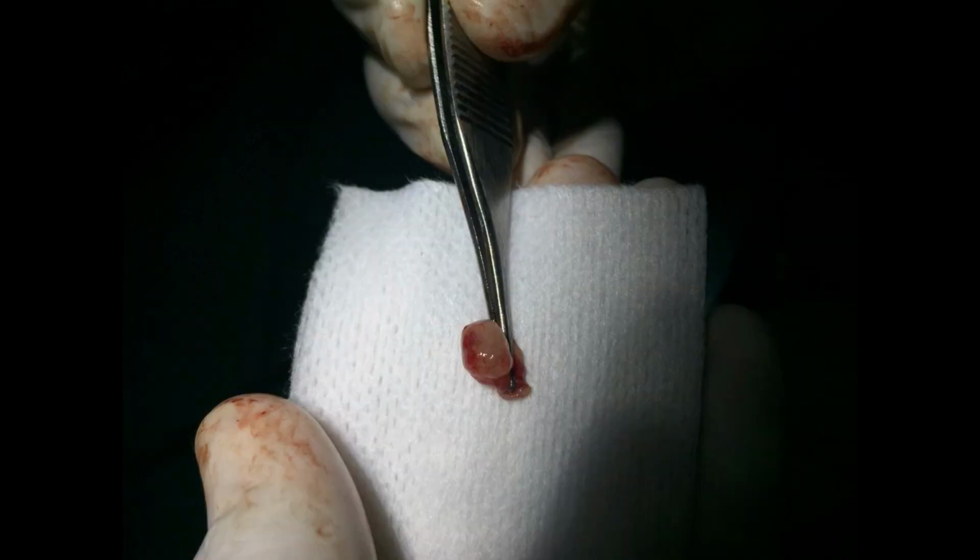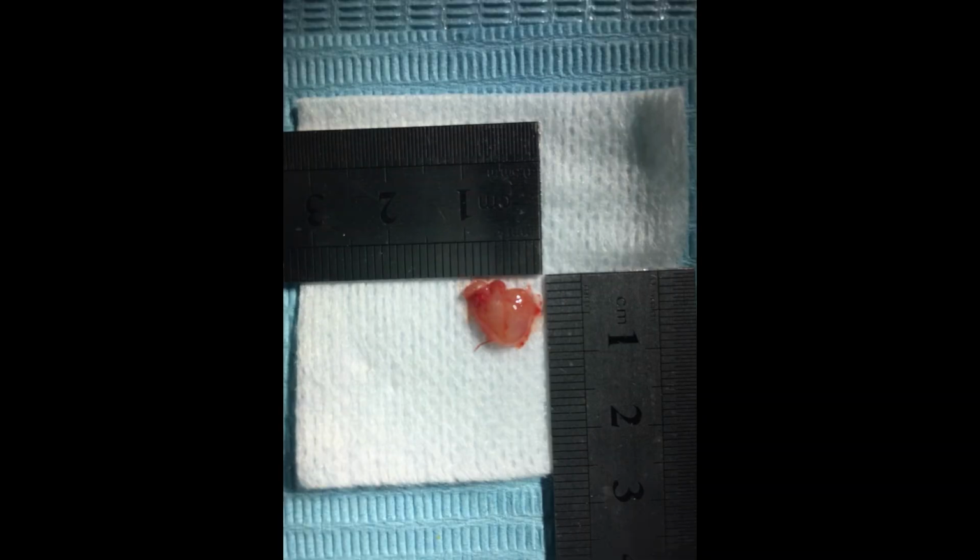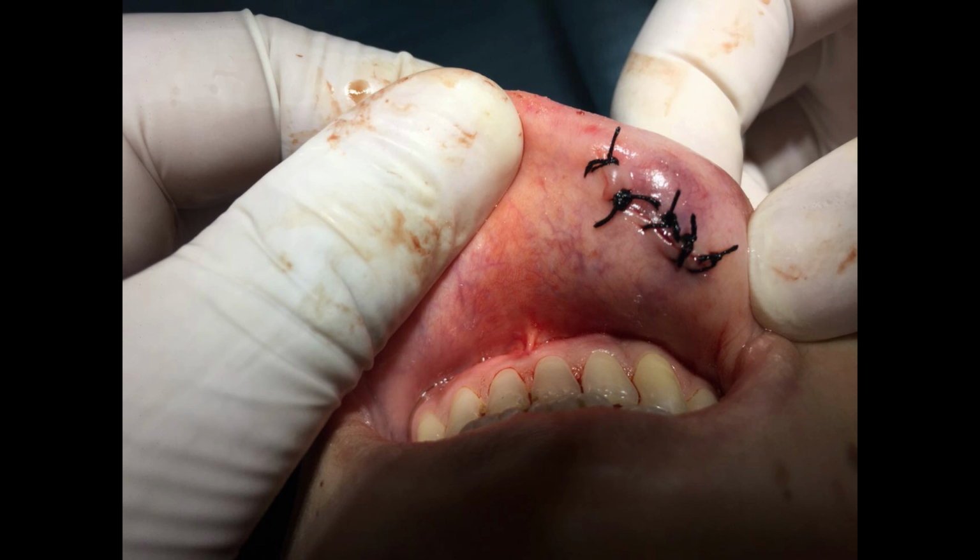The area afterwards was closed using 3-0 silk sutures, interrupted, and as we can see, the size of the lesion was roughly around 10 millimeters, and the patient was happy. Then we recalled the patient after 9 days, and it showed satisfactory healing in the area.